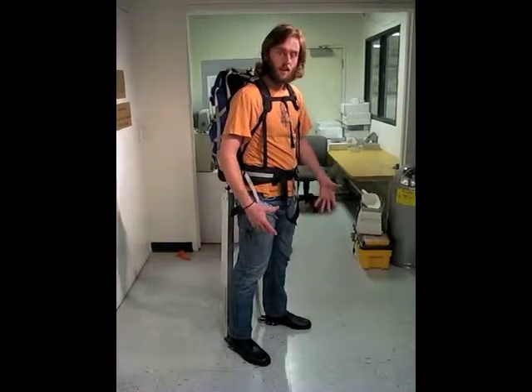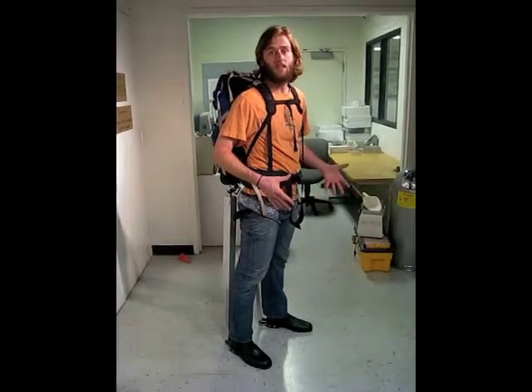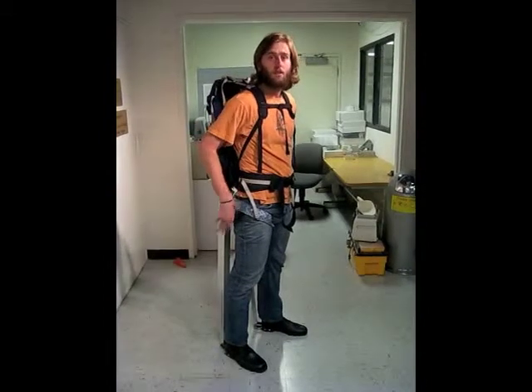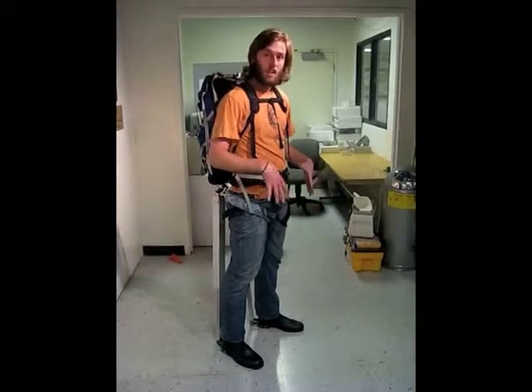As my feet are on the ground, the mechanical brakes are engaged, locking both telescoping rods together. This allows for the 50-pound load in my backpack to be transferred directly to these telescoping rods and into the ground, bypassing my back, legs, and joints.